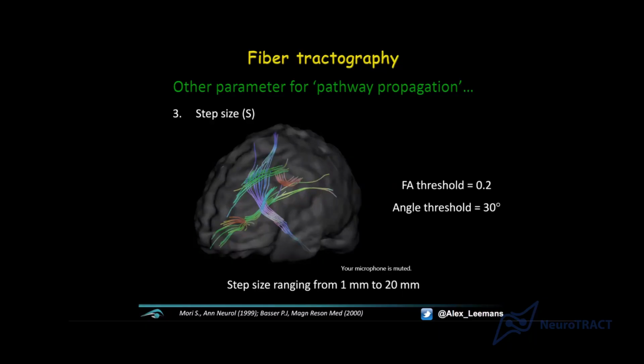If you want to go for a very high resolution image, so very small voxels, that means that your signal to noise ratio will go down. So if you have a small voxel, there's less signal in there in a way. There's more noise in there. And this is also something you see in general cameras, right? So very high resolution cameras might be very high in resolution, but they will be quite noisy. They will have some noise in there.